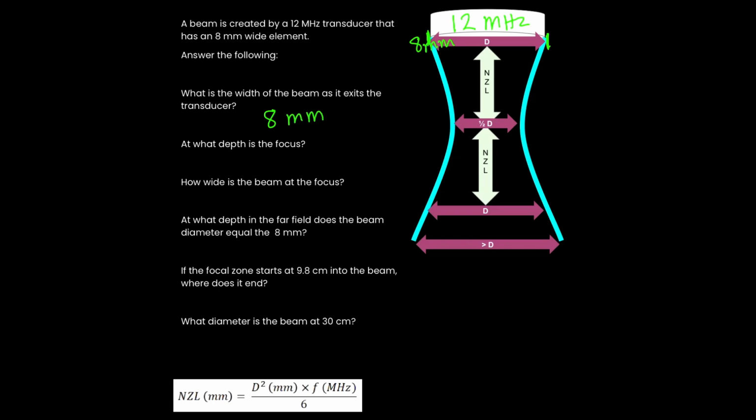The next question is asking, at what depth is the focus? So the focus is right where the beam is becoming narrowest. And we know that that is at the end of the near zone.